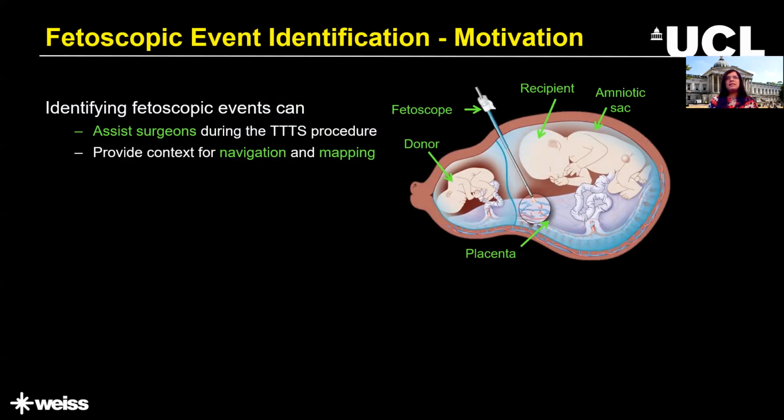By automatically identifying fetoscopic events, we can assist the surgeon during the TTTS procedure. This can also provide us context for navigation and mapping.